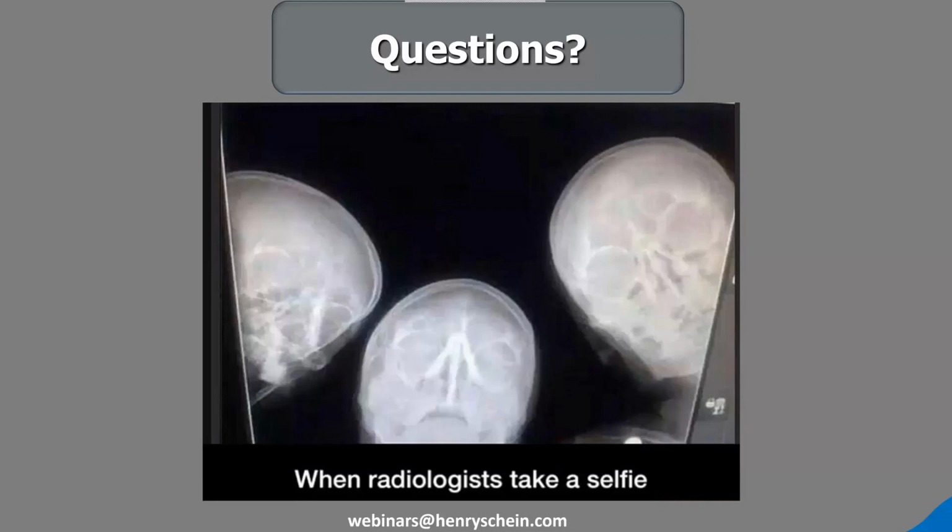A lot of people are looking into medical billing because medical billing will pay for the cone beam CT. Others will charge it as part of maybe an included fee. So the price of your implant includes X, Y, and Z, including the cone beam CT, because you know that you need it. Others will charge it out as maybe a pan or ceph if it's a large field of view and does get the condyles. But we're starting to see insurances just beginning to pay for these. And I think that a majority of the way that they're getting paid through insurance is through medical insurance. So medical billing is becoming very, very popular.